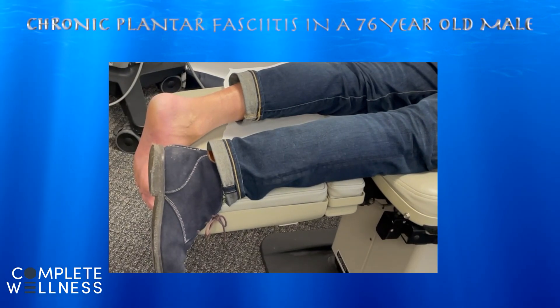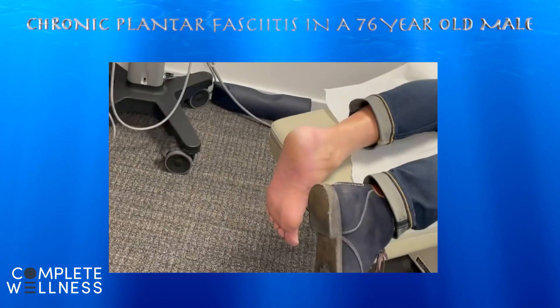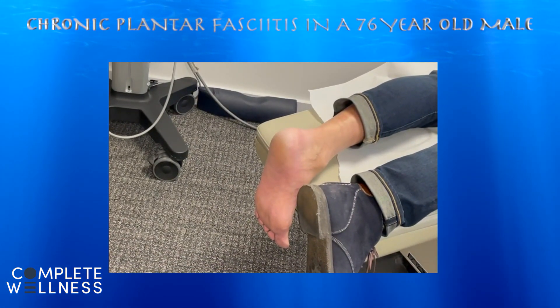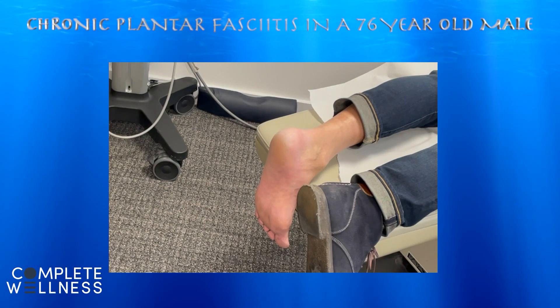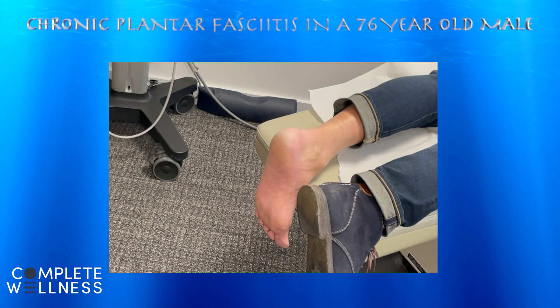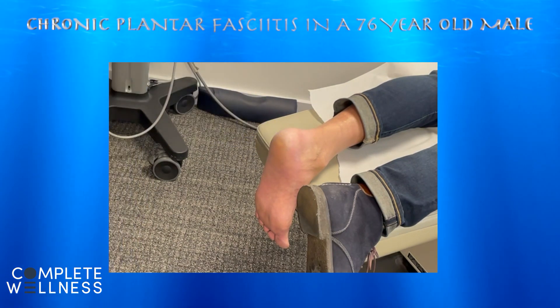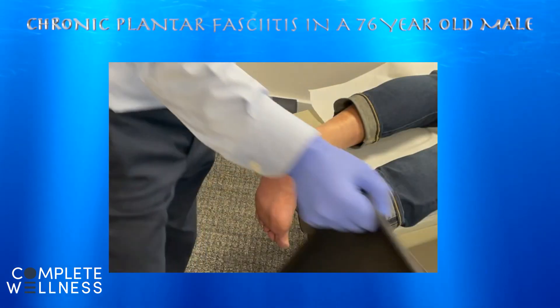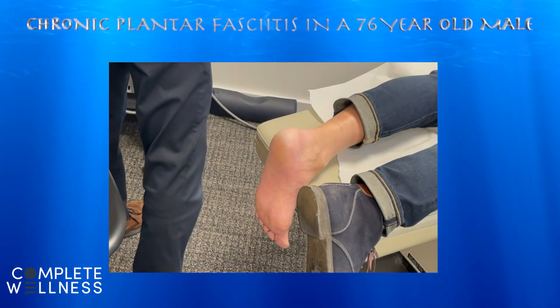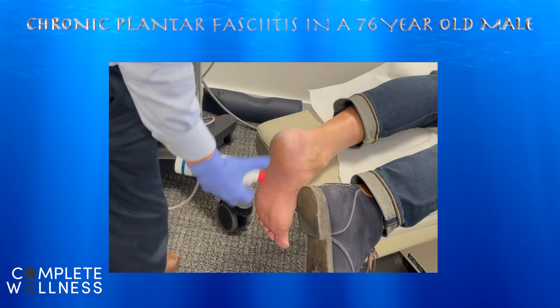76-year-old male presenting for pain at the bottom of the left calcaneus, going on for about a year or so, worse when he sits for a while. On exam, he is mostly tender at the bottom of the calcaneus, although he also has pain at the medial process of the calcaneal tuberosity. We are worried about chronic plantar fasciitis as the main etiology for his pain.